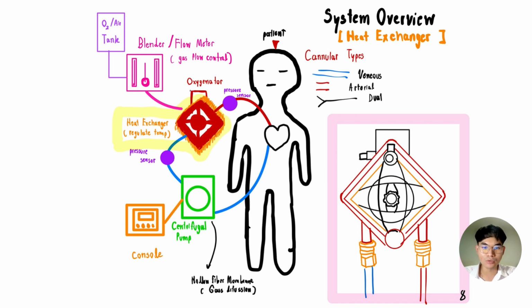organs and tissues. And the study revealed that the ECMO system integrates the heat exchanger with the membrane oxygenator, ensuring that the blood is not only oxygenated but also brought to the correct temperature, simultaneously making the system more efficient and reducing the risk of temperature-related complications like induced hypothermia and thermal swings during the therapy.